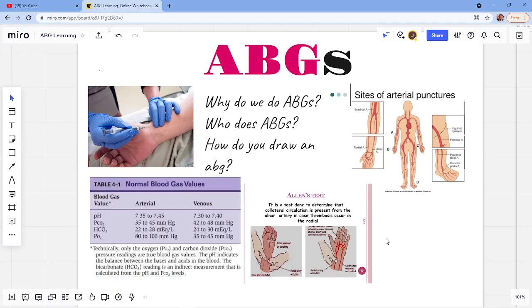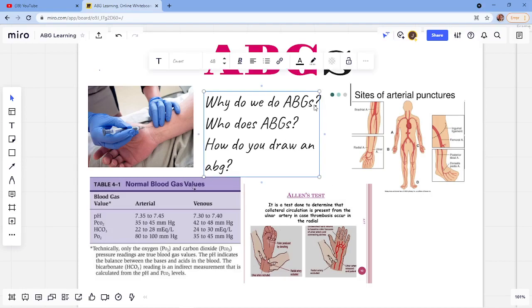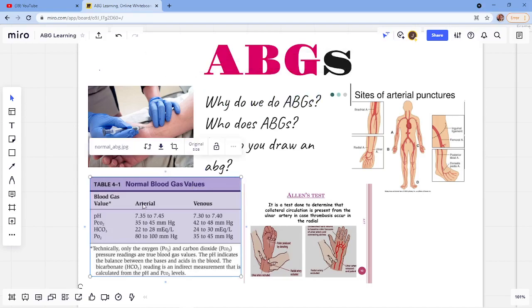This video is going to hopefully help the nursing student or the basic new nurse understand ABGs, why they're important, and how to interpret them. So why do we do an ABG? That's a great question. ABGs are typically done to evaluate respiratory dysfunction. But ABGs can also be drawn for other reasons, not just to interpret respiratory function. Some types of overdoses, metabolic disorders, and organ dysfunctions can cause alterations in your ABG values that you're going to see here on the left-hand screen. We're going to break down these values and figure those out together, and hopefully by the end of the video you'll know why you're doing an ABG.